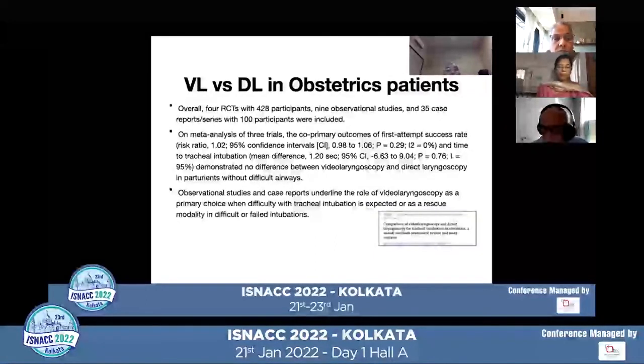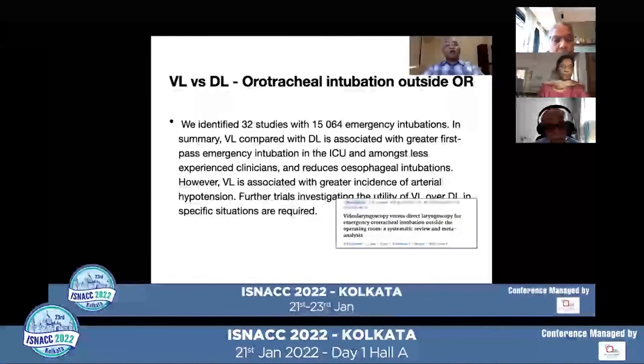In obstetric patients, 4 RCTs with 428 participants, 9 observational studies, and 35 case reports were included, where 100 participants were there. First pass success rate and time for tracheal intubation demonstrated no difference between video laryngoscopy and direct laryngoscopy in patients without a difficult airway. But observational studies and case reports underline the role of video laryngoscopy as a primary choice when difficulty with tracheal intubation is expected, as a rescue modality, or in a difficult or failed intubation.